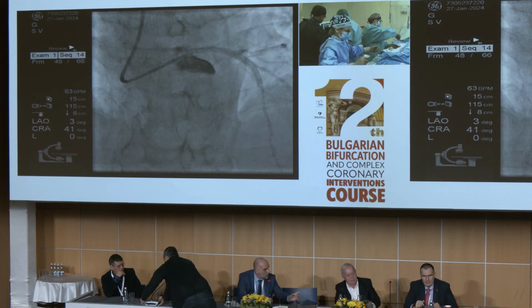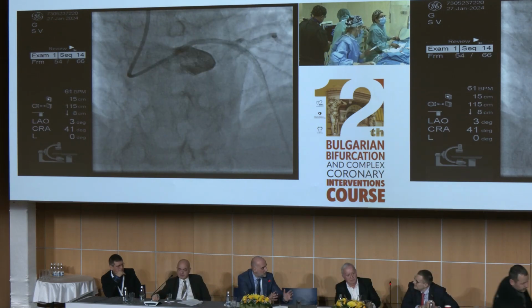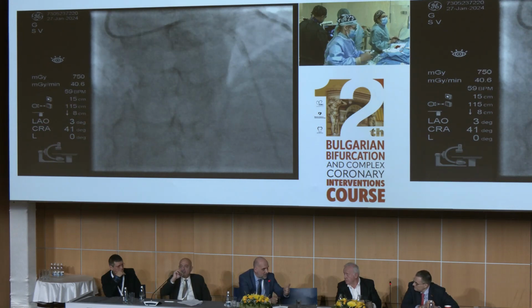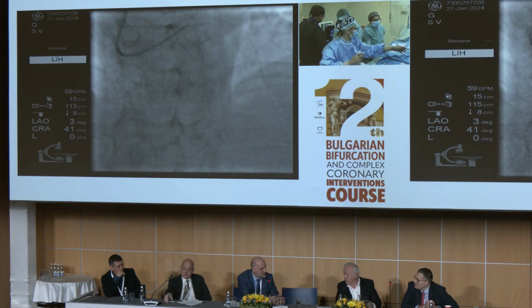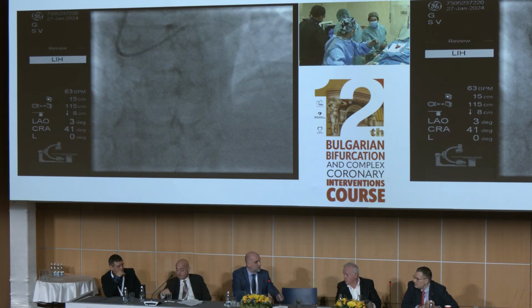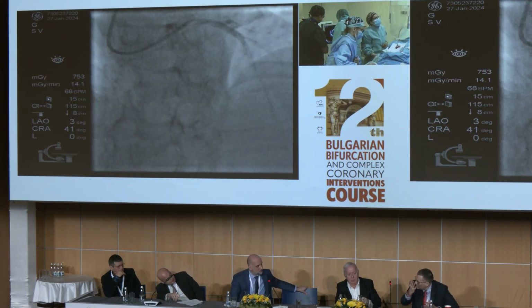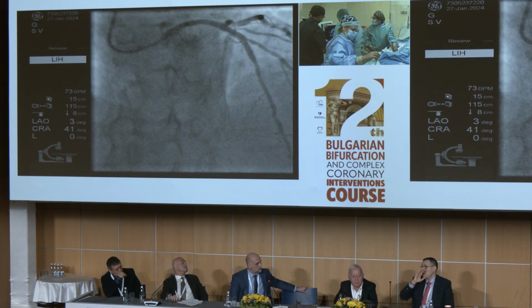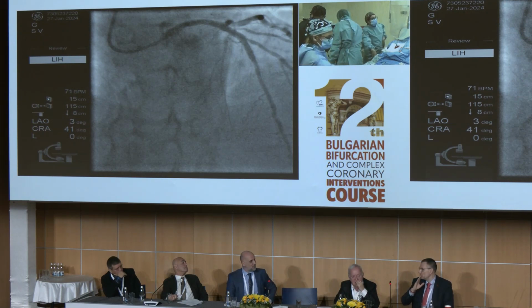Okay. Dobrin, I have one question. In case we have 2 stents in the bifurcation, we must make a new carina. Can we use POCI? Yes. Is it enough? It's not necessary to first kiss and after that POT? It's up to you if your balloon crosses the side branch direction. It's not a problem to use. My suggestion is to use 7 French. Just easier.